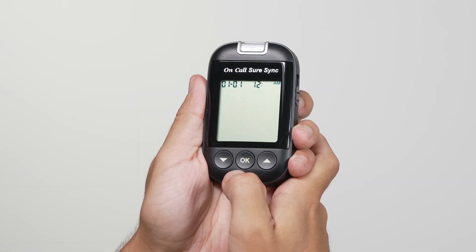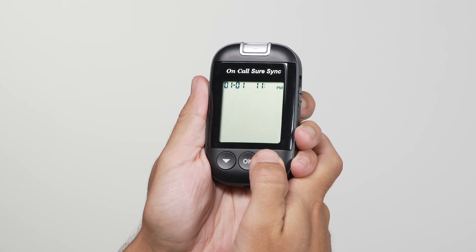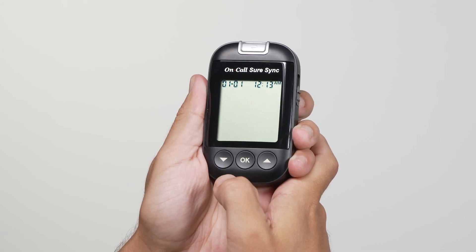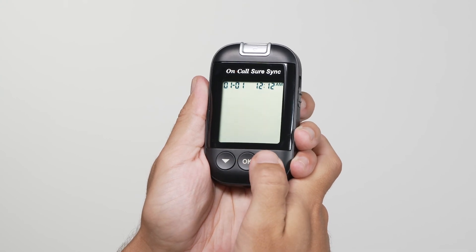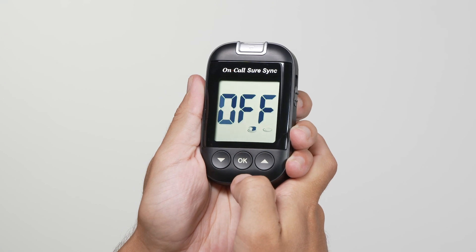The hour will appear at the top of the display. Adjust the hour with the down or up button until the correct hour is displayed. Press the OK button to save your choice and set the minutes. Press the down or up button to change to the correct minute. Press the OK button to save your choice and move to set the meal marker feature.